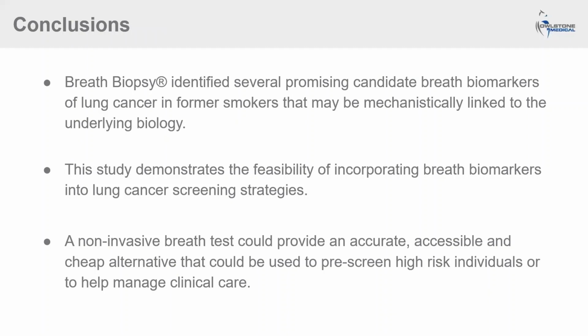The value of breath VOCs to predict cancer risk could be further assessed by following the indeterminate nodule group over time to identify those that develop cancer or are confirmed as benign. Finally, given the ease of non-invasive sample collection and the promising accuracy indicated by this feasibility study, breath biopsy may reflect a new modality for pre-screening at-risk individuals and to help manage their clinical care.